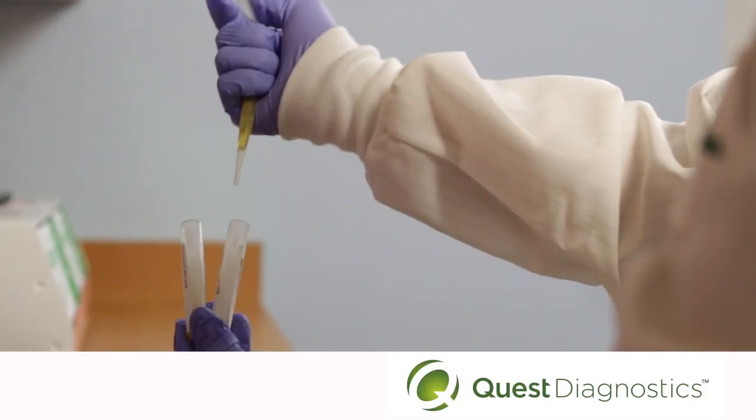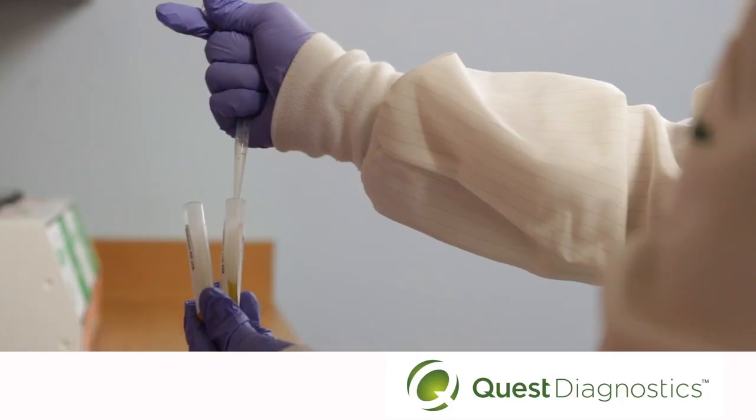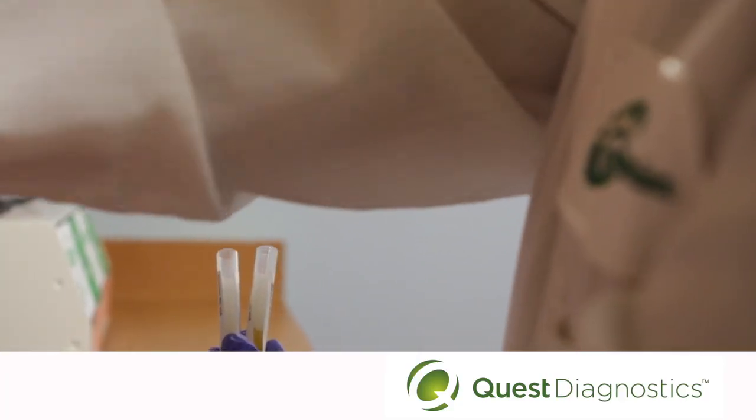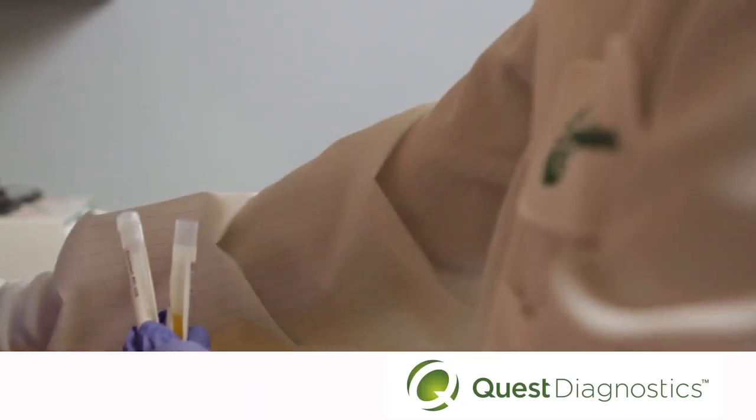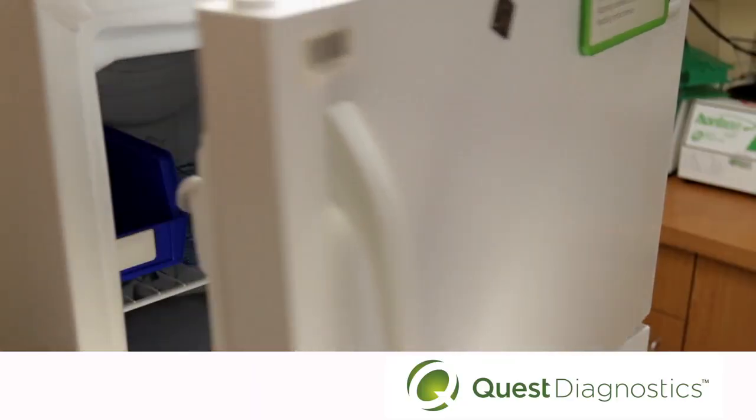Pipette the plasma from the second spin into a labeled aliquot tube. Remember, you need to pipette the plasma and do not disturb the bottom one half milliliter. Promptly cap and freeze the specimen.